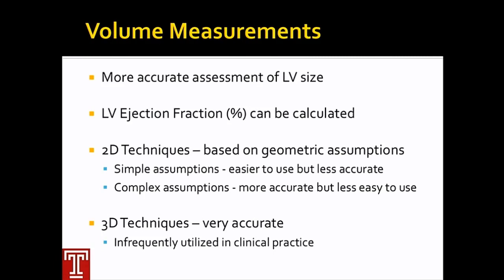But this has become less of a problem in today's very digital world, because some of the more complicated assumptions can now be done on the fly while you're doing the echo, and it actually has become quite easy to use.